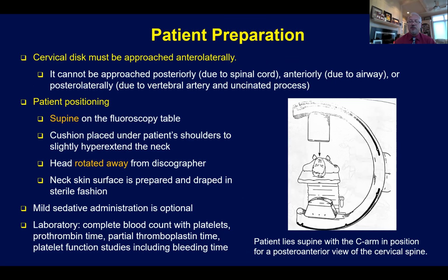Patient preparation: the patient is placed in the supine position. The head is rotated to the contralateral side. So if we're entering from the right side, the head is shifted towards the left. We prep the skin and the subcutaneous tissues. Clearly, the skin is prepped with chlorhexidine or betadine. The subcutaneous tissues are infiltrated with the local anesthetic after first forming a skin wheal.